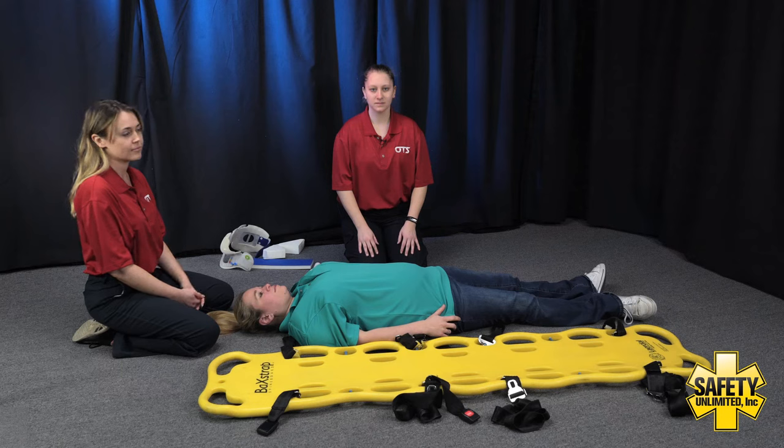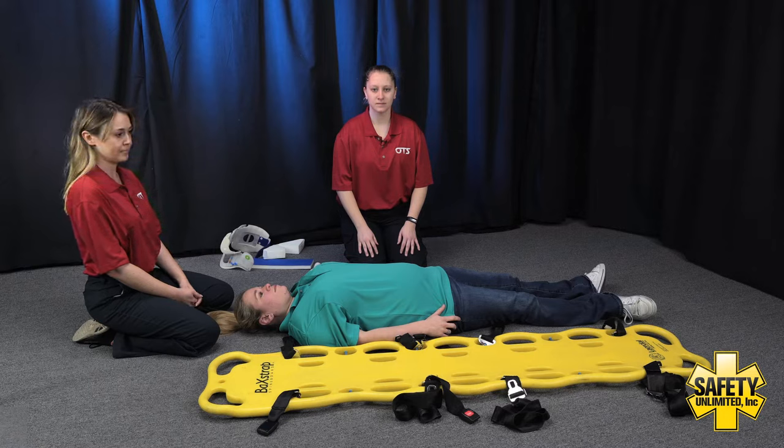This skill is designed to evaluate your ability to provide spinal immobilization to a supine patient using a long spine immobilization device. You arrive on scene with an EMT assistant. The assistant EMT has completed the scene survey as well as the primary assessment, and no critical conditions requiring any interventions were found. The simulated patient's vital signs will remain stable. You are required to treat the specific isolated problem of a suspected unstable spine using a long spine immobilization device.